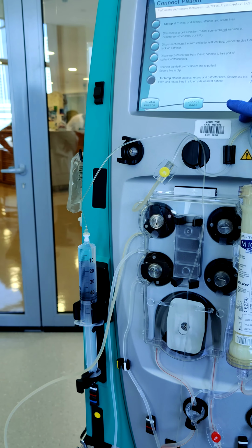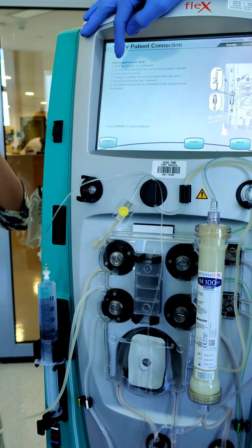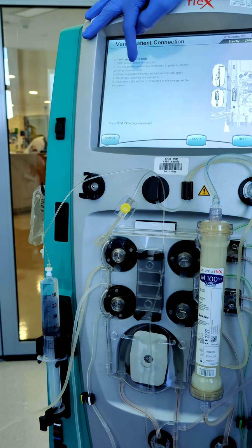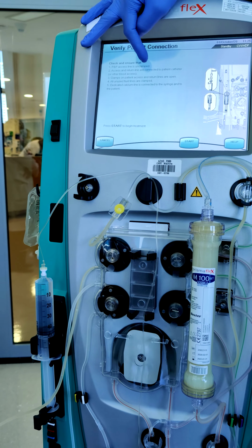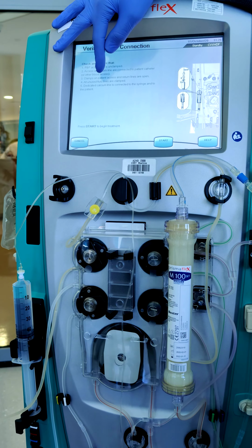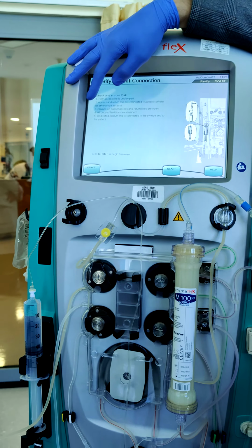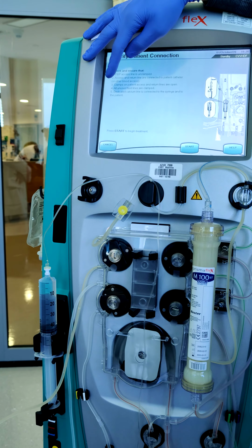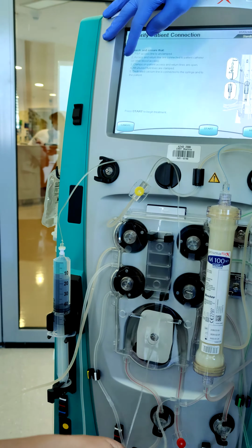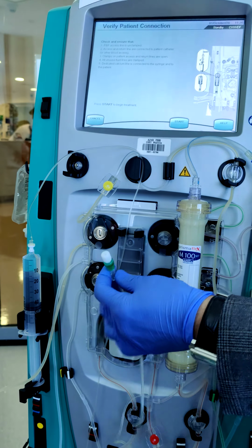Just continue. Check and ensure that the pre-blood pump access line is unclamped. Access and return lines are connected to the patient catheter. Clamps on patient access and return lines are open. All unused fluid lines are clamped. If you are not using any line, you can clamp it, like now the syringe line. We are not using heparin or systemic, we are using this regional, so we clamped it.